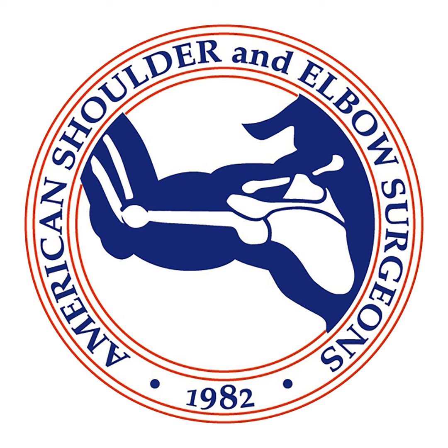It's kind of the same thing with stemmed implants, where I'd pass the sutures through bone tunnels and then around the stem of the implant before we fully impacted it, so that if we lost fixation of the bone tunnel, we'd still have sutures around the implant. So that's been my technique with stemless humeral components for LTOs, and that's worked quite well.